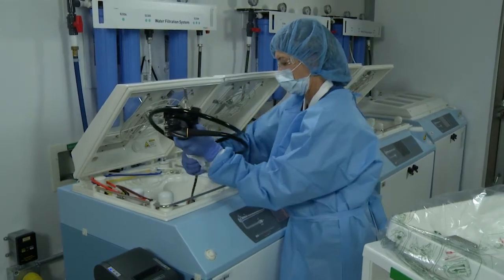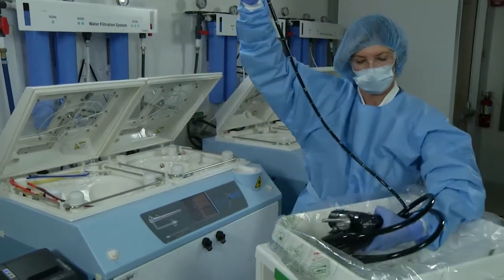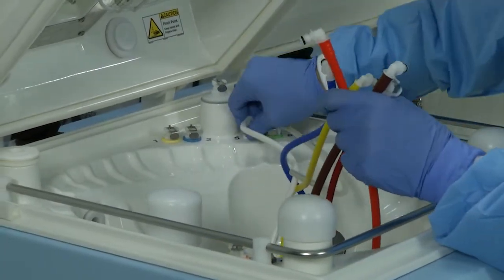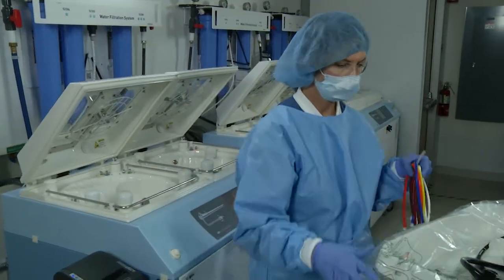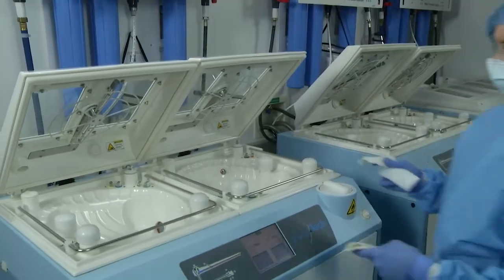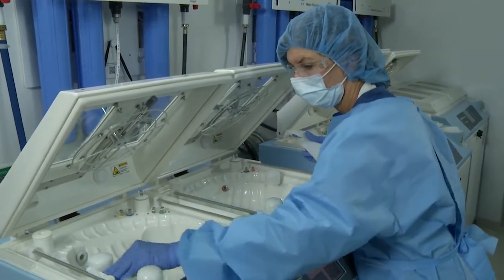After the last cycle of the day, remove endoscopes from the basins. Remove and store all connectors. Wipe the edge seals with alcohol. Wipe the basin with a clean, lint-free cloth.